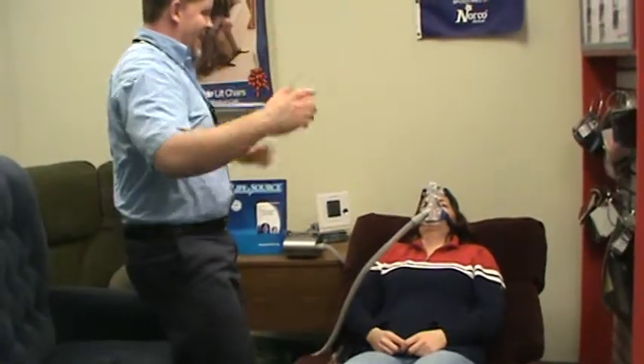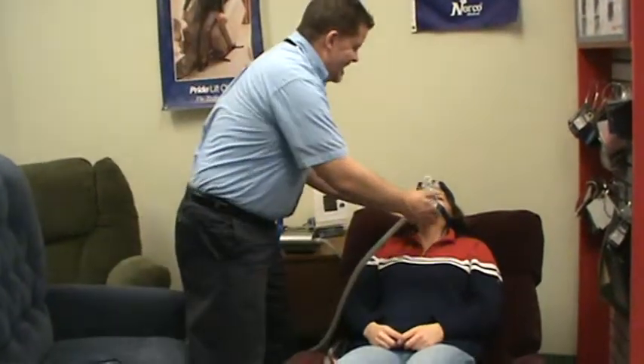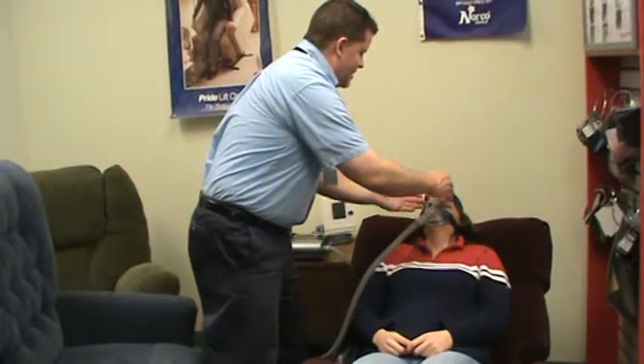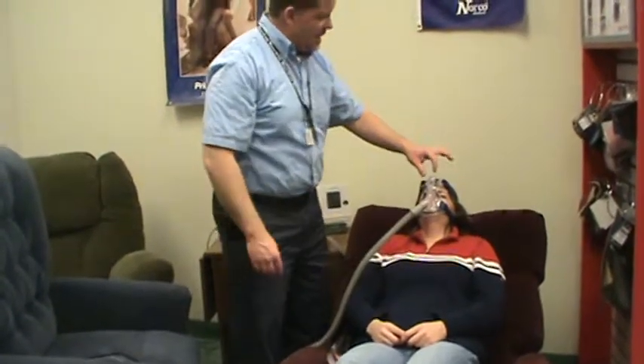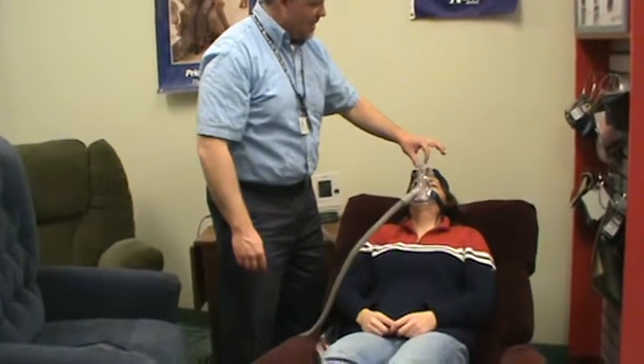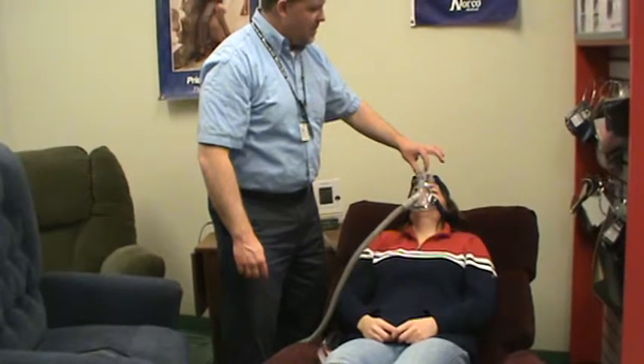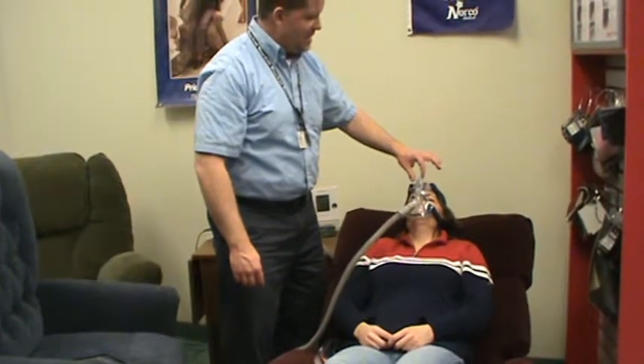Are you ready? I'm going to feel around the edge of the mask, just to feel if I can feel any leaks. I'm going to let you feel the difference in that dial. Can you feel that pressure switch from your chin to your nose? Thumbs up or thumbs down?